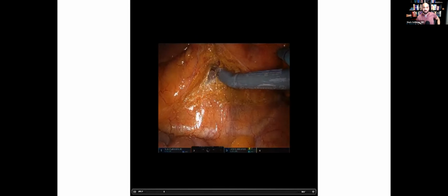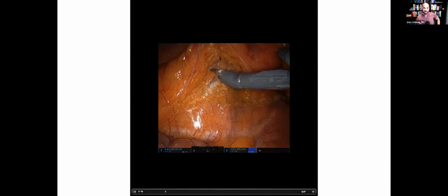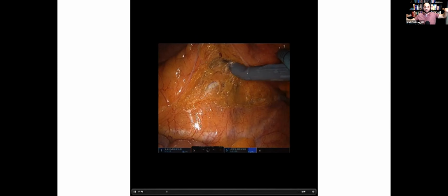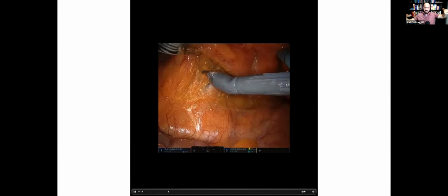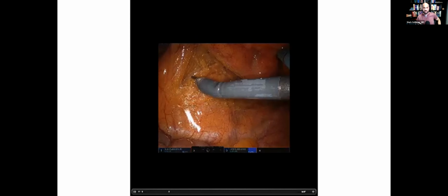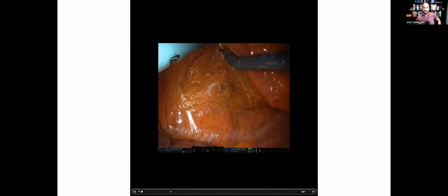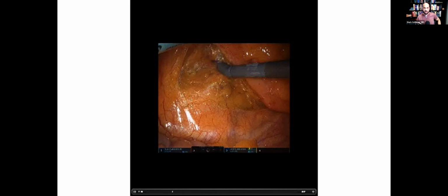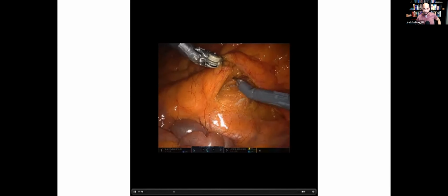Okay. Dr. Bastaros always talks about scoring the peritoneum from basically the ligament of Treitz all the way down to the presacral space, and then he'll do the dissection from that. There's nothing wrong with that. I think it's a great idea. The assist is helping. I don't see where this surgeon's third arm is, which can be a marker of someone that's pretty early on their learning curve, especially where you see they passed points there.